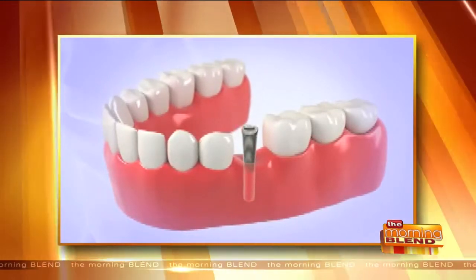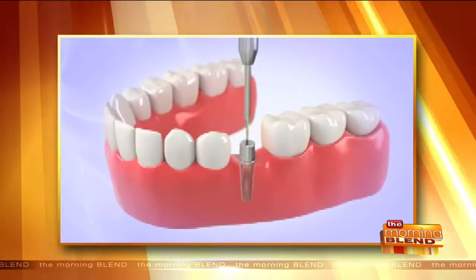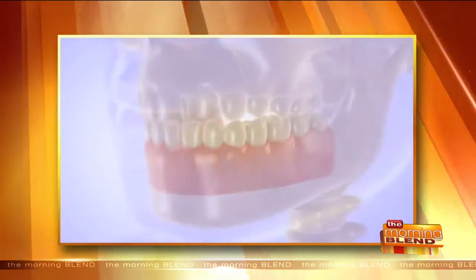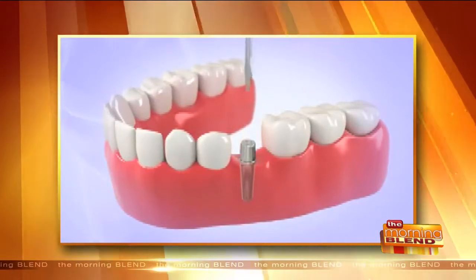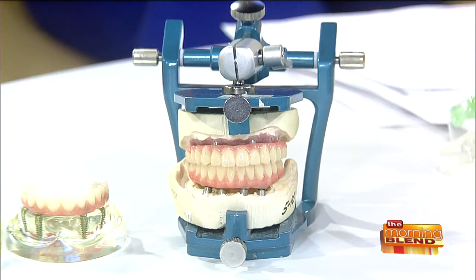Basically. So if we look at the screen here, we could actually see how the implant goes into the jawbone. Over the implant, we place what's called an abutment, and then over the abutment, we place a crown. So basically, the crown is replacing the tooth. Yes, it's the tooth that we actually see. And I brought some examples of an implant. The last time we talked about it, I brought this really big, huge one. I actually brought one that is the actual size of an implant. And they're very small titanium prostheses that go inside, again, the bone.